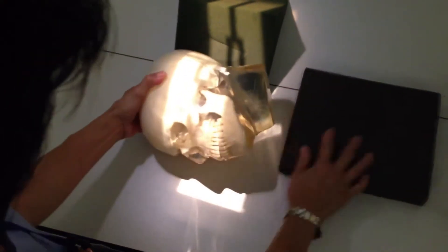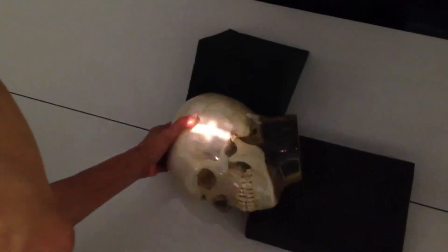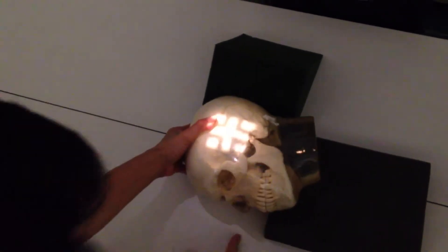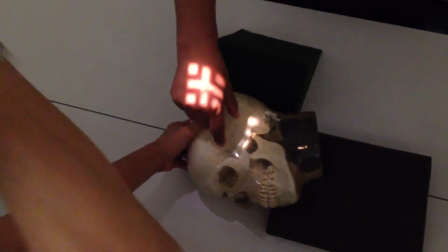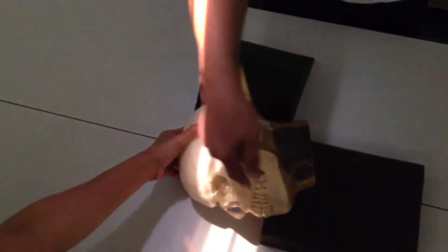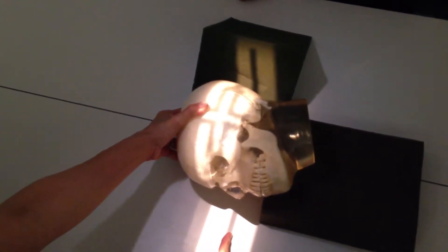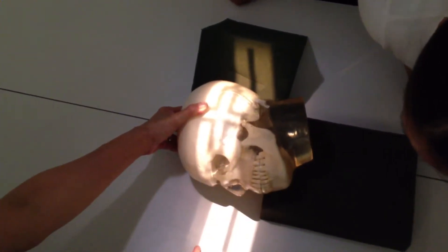The same thing with TMJs. I'm going for the down one. But now I know how small the TMJ is — don't let it scare you. As long as you know your positioning and your CR is centered with all of this, you'll be fine. What's important is your exit point. This is my exit point. The newer texts, I think they just eyeball and they'll do something like this. There's my TMJ.